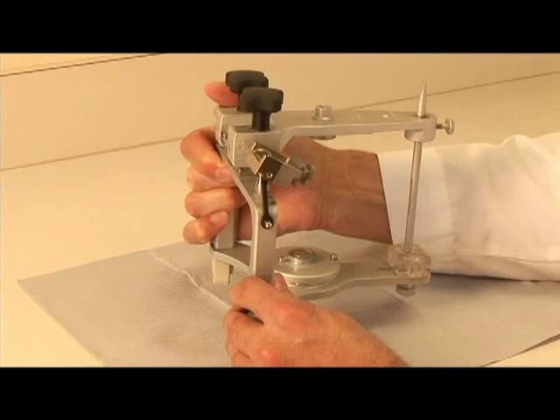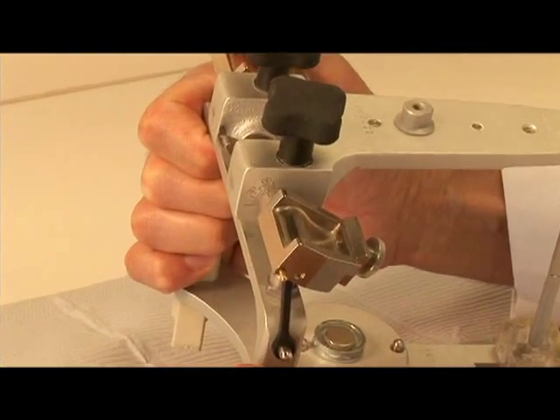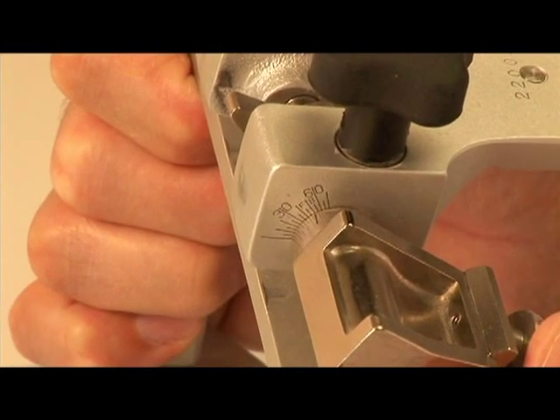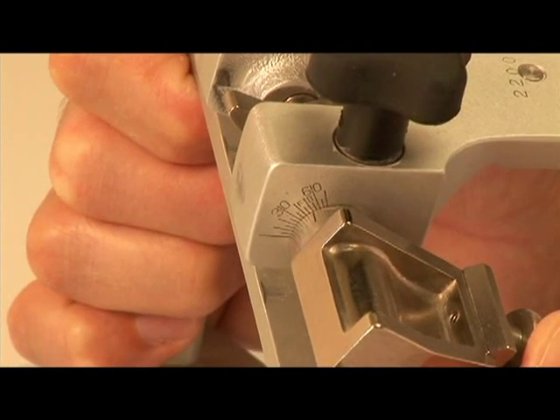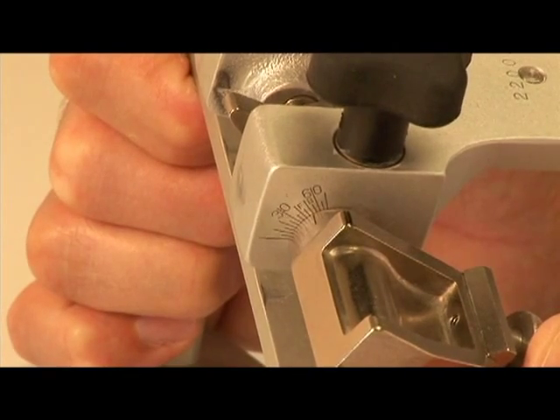The first setting that we are going to check is the condylar setting. That should be in the FB position as indicated on the right condyle element on the articulator. Both the right and left condyle settings should be set prior to mounting at the face bow position.